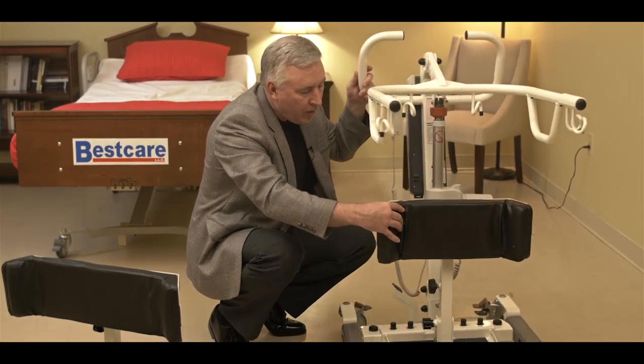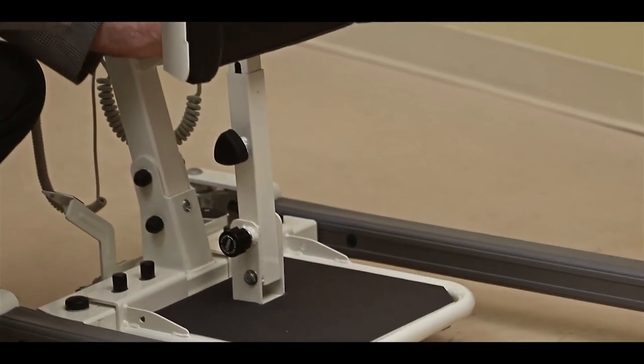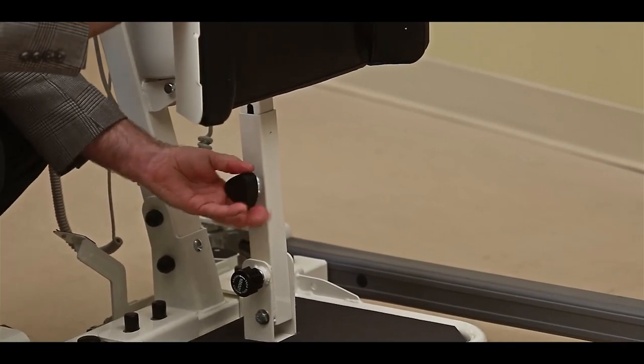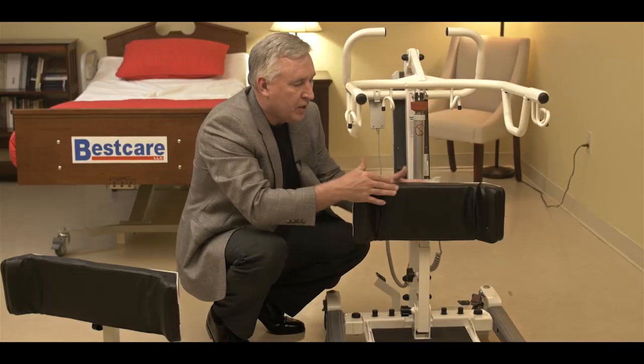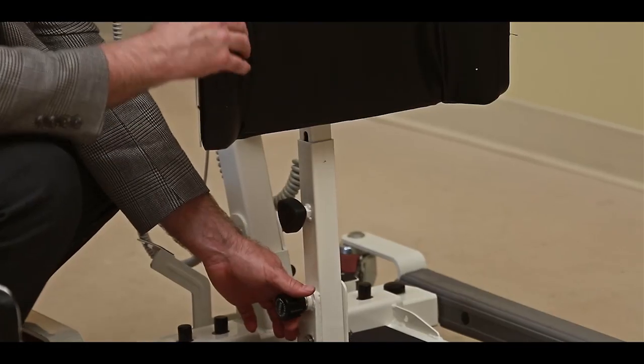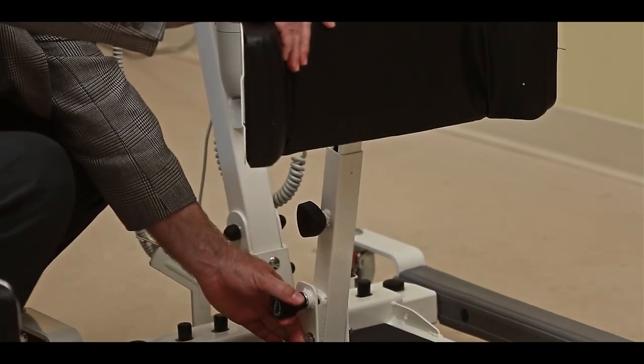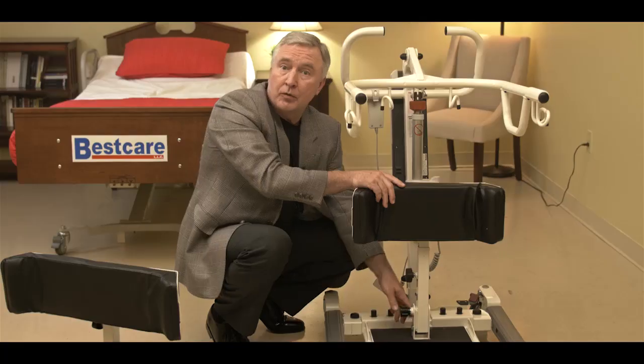We can raise and lower the knee brace with a knob on the side — just loosen it, raise it to a comfortable height, and tighten it again. We can also adjust the position of the knee brace with a knob at the bottom. When we pull it out, we can tilt the knee brace forward, or we can put it back to make it comfortable for the transfer.